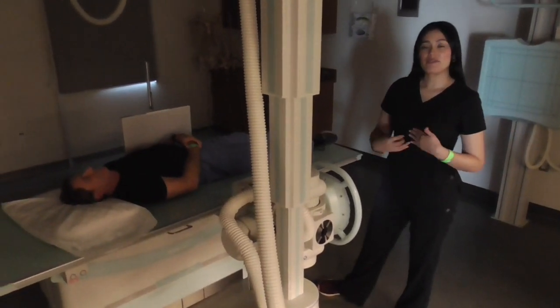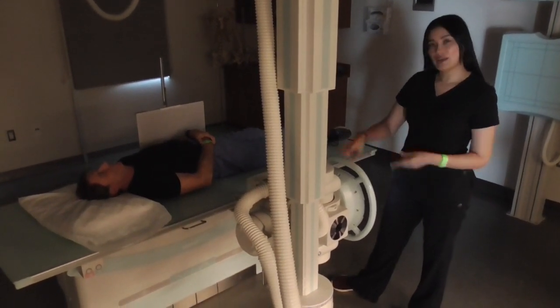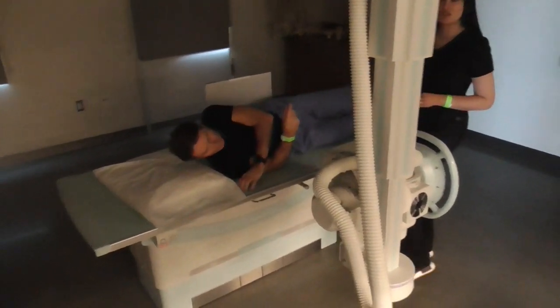I'll now be demonstrating a ventral decubitus, so that means with my patient prone, laying on their stomach, using a horizontal beam. So I'm going to have him roll onto his tummy in the PA position.